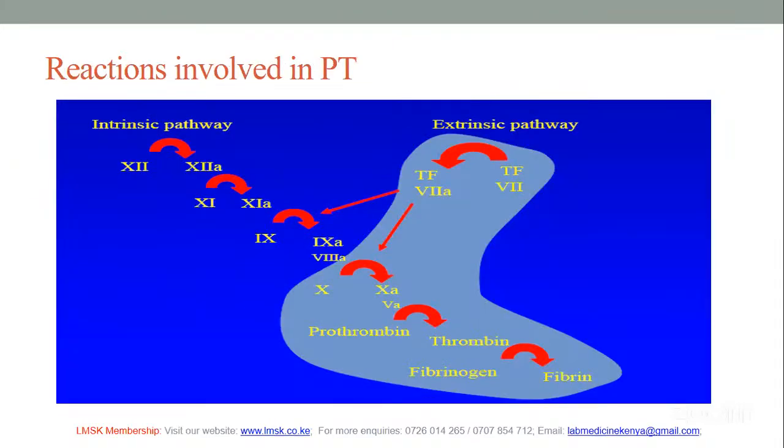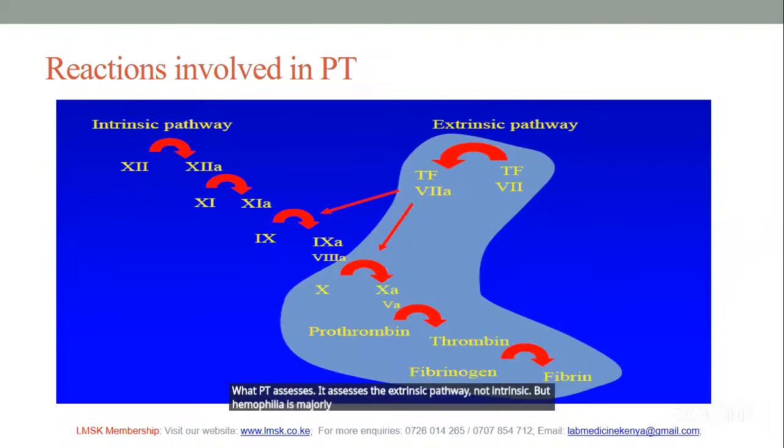This is the reaction. This is just a simple way to show you what PT assesses. It assesses the extrinsic pathway, not the intrinsic. But hemophilia is majorly in the intrinsic pathway, factor 8 and factor 9. Next slide.